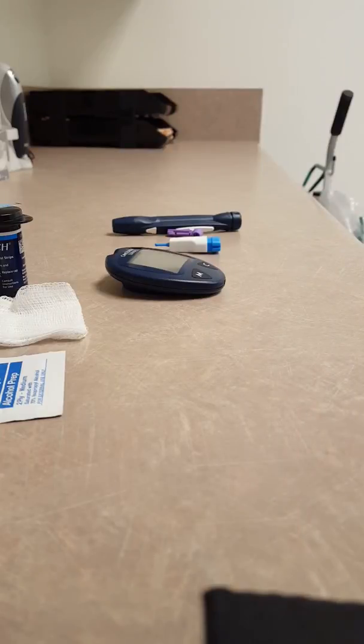Hey everyone, Jess the Nurse here. This is going to be a quick video on how to check your blood sugar.